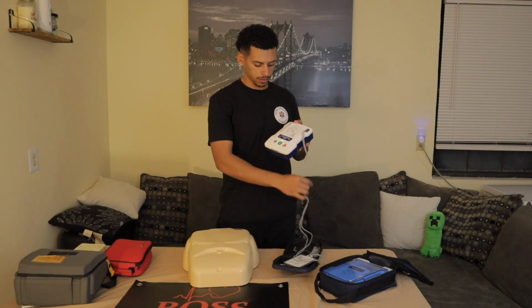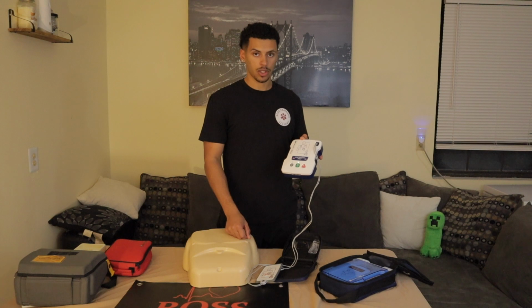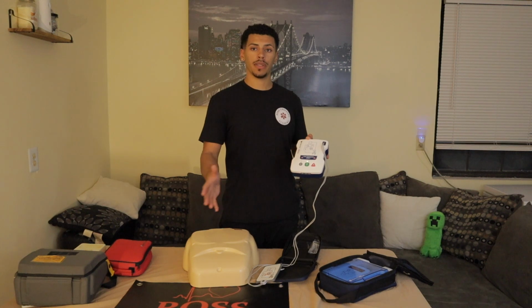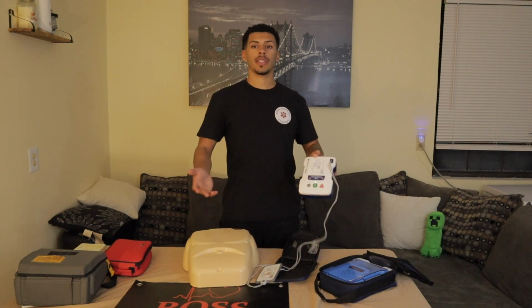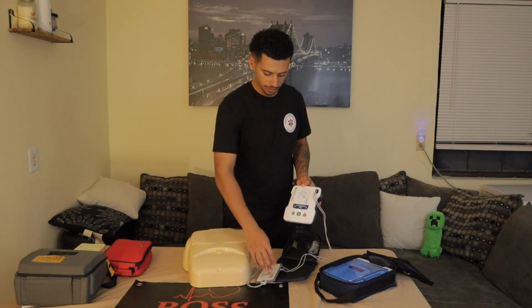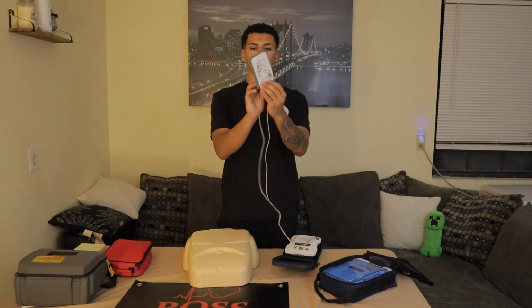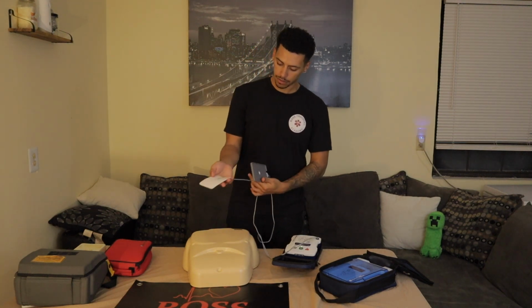Adult patient. If the patient is a child, press the child button. Remove clothing from the patient's chest. Remove packet and apply pads onto patient's bare skin. So I'm not going to do it. Just apply pads as shown in the pictures. Still not going to do it. Remove packet and apply pads onto patient's bare skin. And it's just going to keep telling you to put Apply the pads pads as shown in the pictures. So Remove packet we'll and apply pads onto patient's bare skin. Pull it off. Apply pads as shown in the pictures.